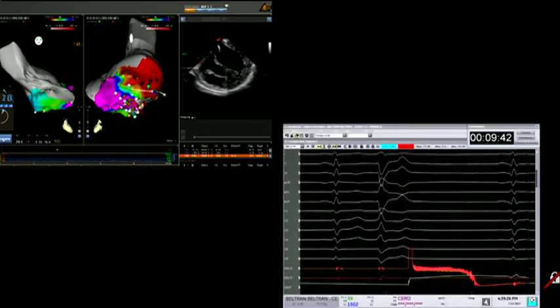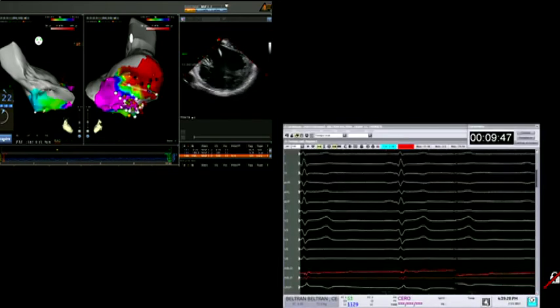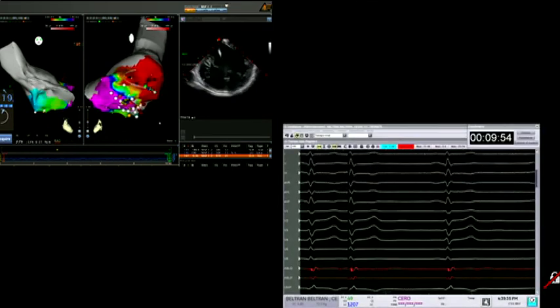The image of the polygraph is flickering. Show the recording in sinus. Look at those potentials. Mark those late potentials. They're all delayed potentials. Yeah, look at this. Move the map to the left, please. Clearly, that's an abnormal substrate. All right. Yes.